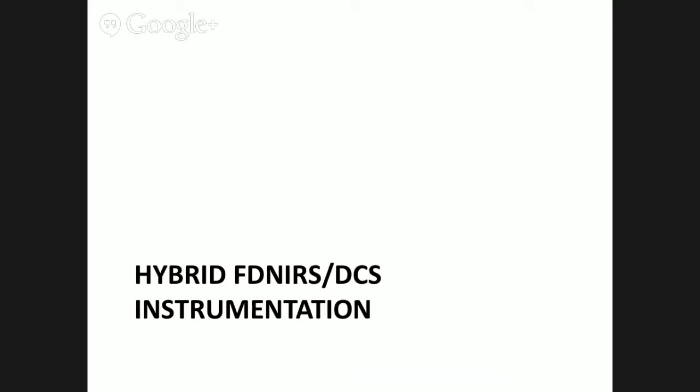So my goal is to take these novel optical techniques and bring them to the clinic with the goal of individualized bedside patient monitoring. And with these aims in mind, we've been working to commercialize a new FDNIRS DCS instrument. This was done in collaboration with Canon USA. And the goal of this new instrument is really to streamline our measurements.